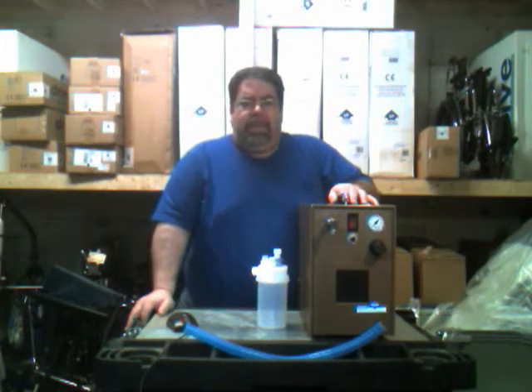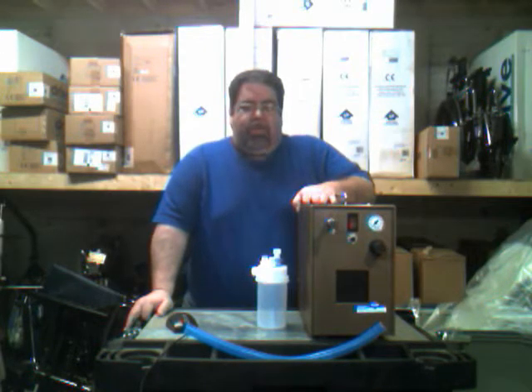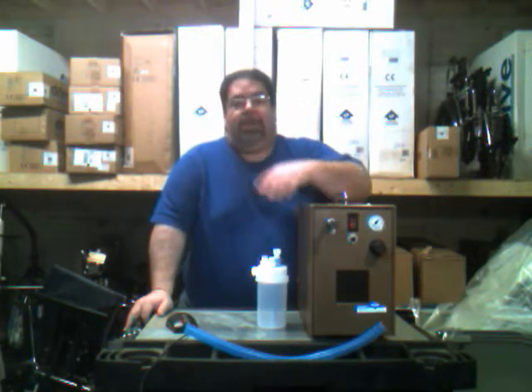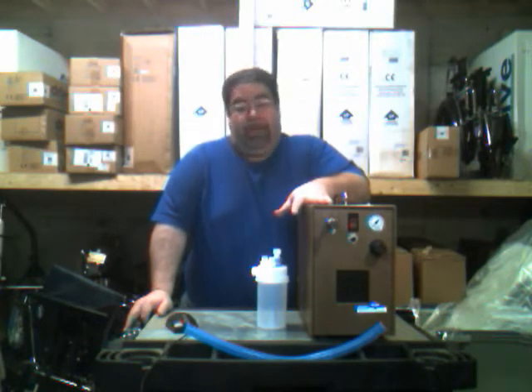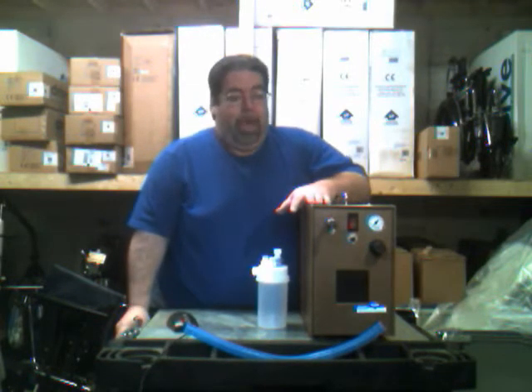Good morning. This is an in-service for the John Bunn 400A 50 PSI compressor, which is used for trach patients in order to keep the trach humid and moist. It's a very simple machine to operate — probably one of the most common ones on the market and many of you have probably already seen it. It's an easy machine to operate.